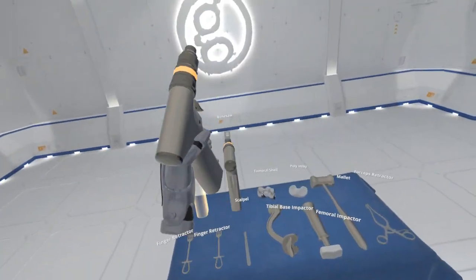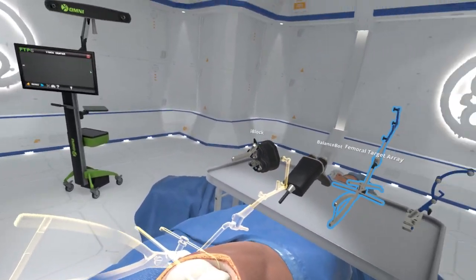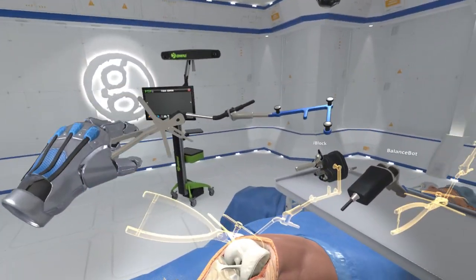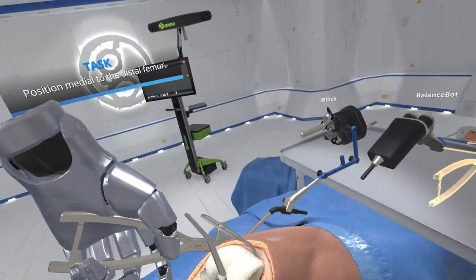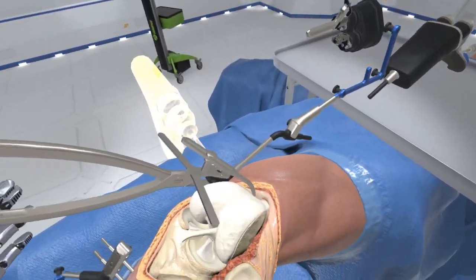Now select the femoral target array already mounted to the I-block femoral cutting guide robot fixation base. Place along the medial aspect of the distal femur. The fixation base clamp will help find the proper anchor placement. 2 anchor pins are required to anchor the fixation base.